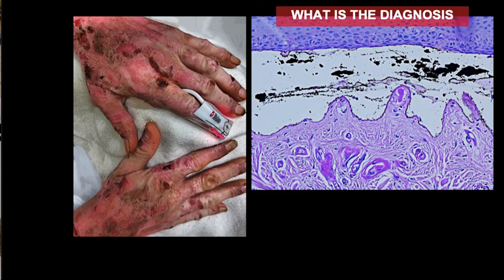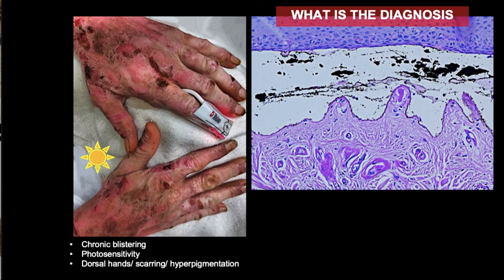So these lesions, when you see in clinic, those patients will tell you that they have those blister formation. When they have them, usually they heal and then they go back again and they burst. If they go to the sun, it is their nightmare. These lesions worsen when they are exposed to the sunlight. And when you look into the histology it is very unique. You see the blister formation, the space is subepidermal. And when you look into the dermis, the dermal papilla is completely preserved.